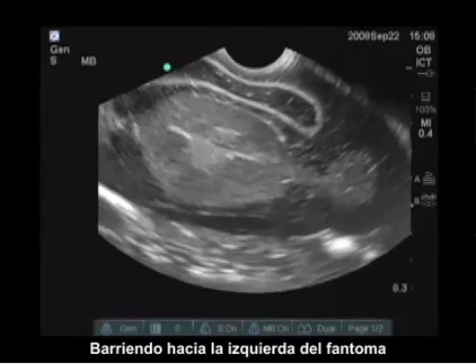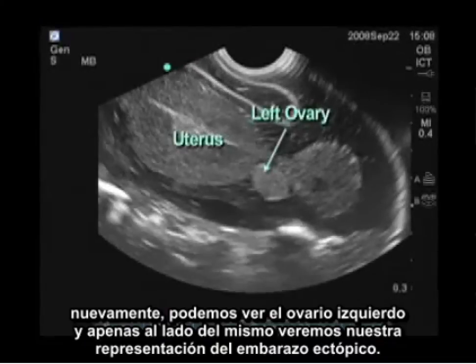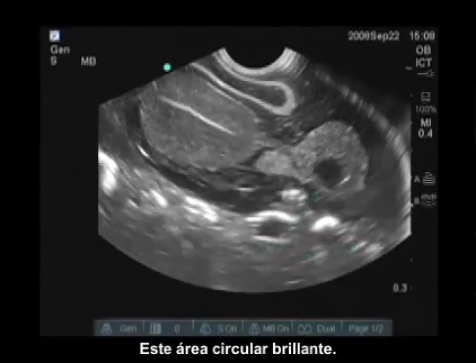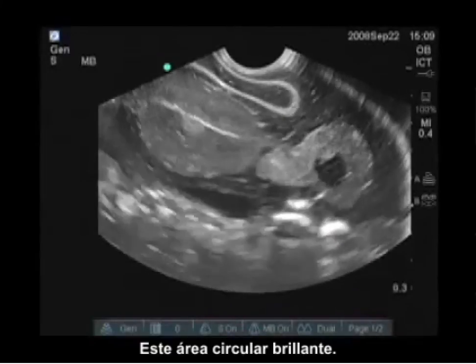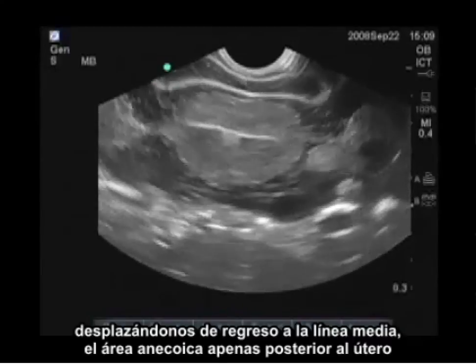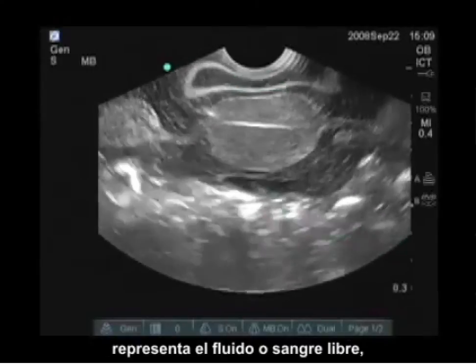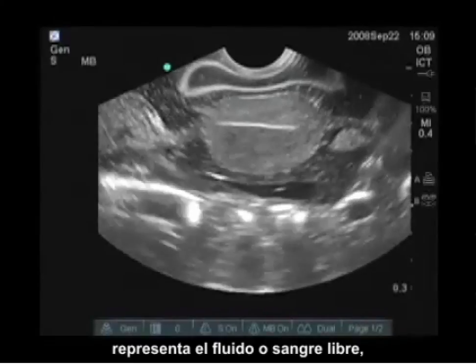If I scan over to the left of the phantom, again we see the left ovary, and right beside it we see our representation of the ectopic pregnancy — this bright circular area. Moving back towards the midline, the anechoic area just posterior to the uterus represents free fluid or blood in this case.